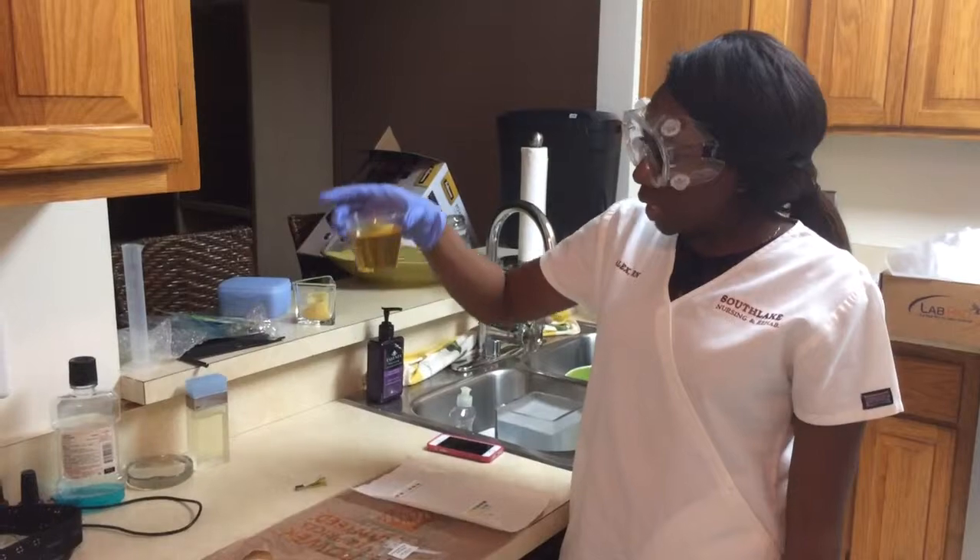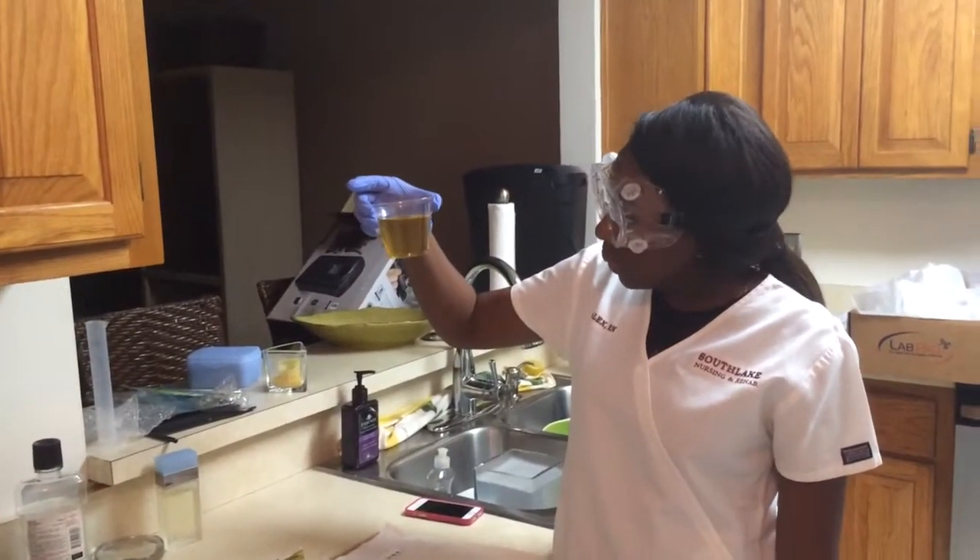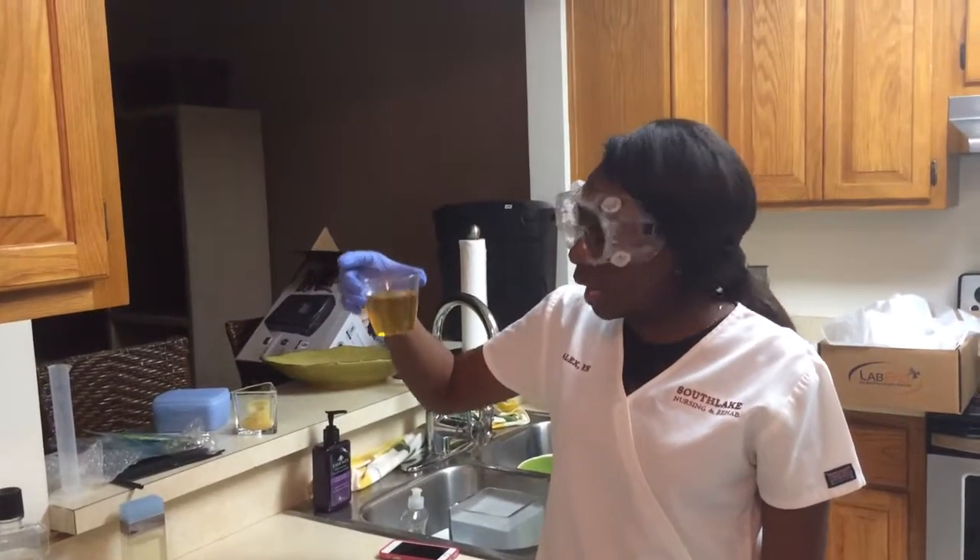As you can see, my urine is pretty dark but it's clear, no sediments, and no odor.